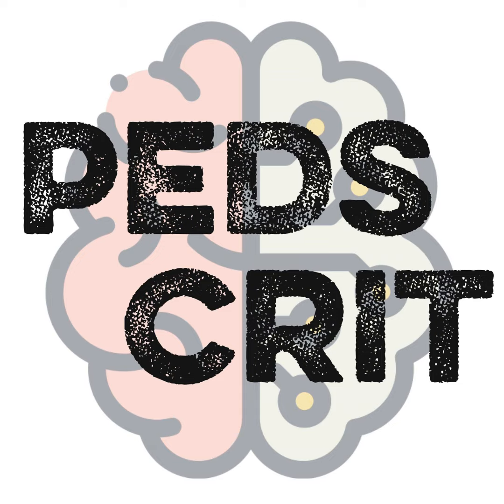And you give the same baby or like a 5-year-old a PIP of 30, it's like, that's a PIP of 30. And so I think people feel that differently about PEEP as well as PIP. And so I think that is a second limitation, which makes us err toward the lower side of things. All of that being said, an escalating PEEP strategy, while being cognizant of an upper pressure limit, you can very successfully get to higher than anticipated numbers of PEEP before you feel you have to go to another mode of ventilation. And like everything else we talk about, it's all risk versus benefit.